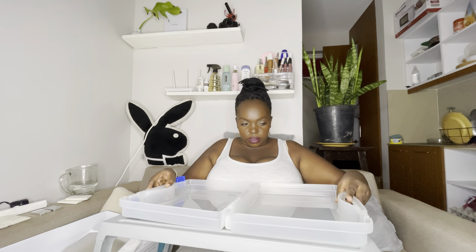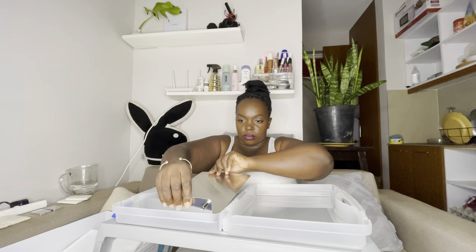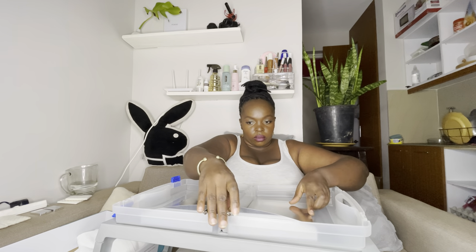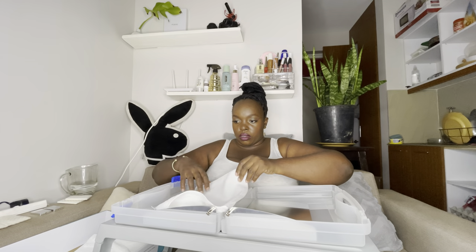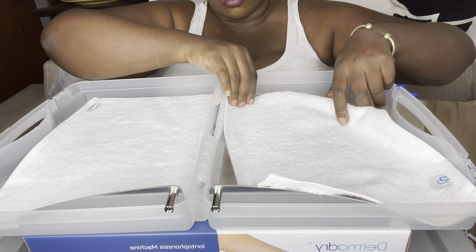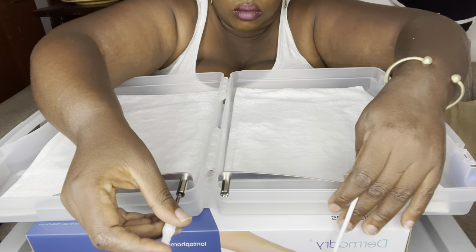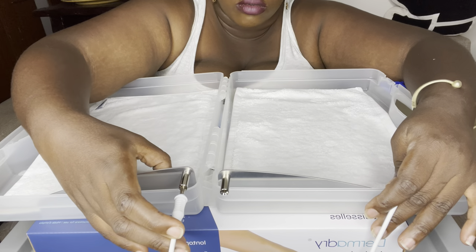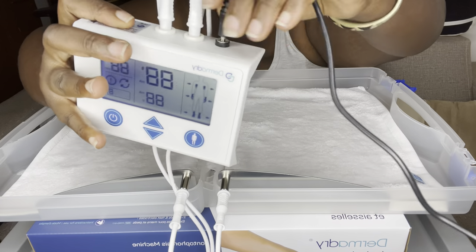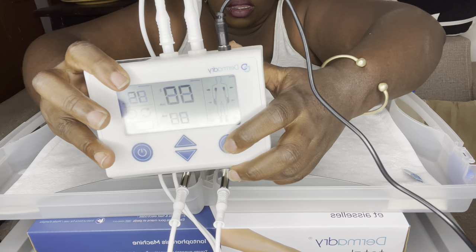For the hands and feet setup, separate the case into two trays and place the trays on a flat, firm surface to avoid spillage. Place a hand and foot electrode into each tray and cover each electrode with a towel. Connect a cable to each electrode while plugging the other end into the connectors on the back panel of the controller.